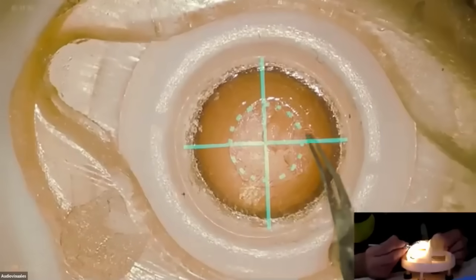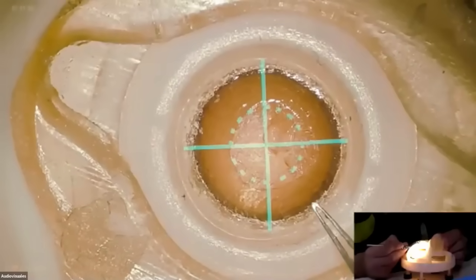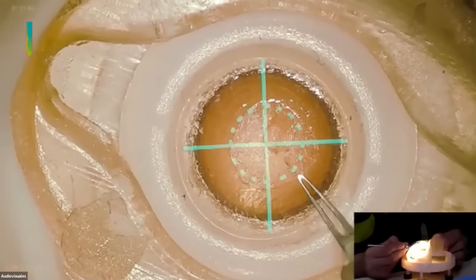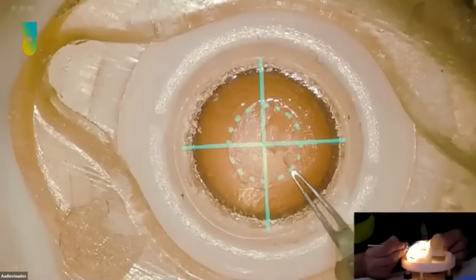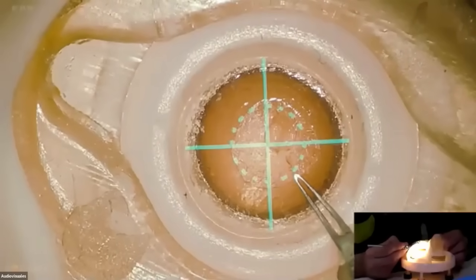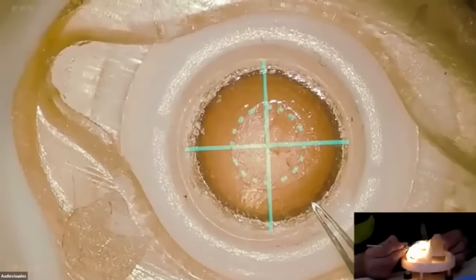And so about halfway down the forceps would be about 2.5, and then a full length would be about 5 millimeters. So you can also guesstimate with the forceps itself about 5 millimeters for an appropriate size capsulorhexis. A very good one. That's a very good topic.